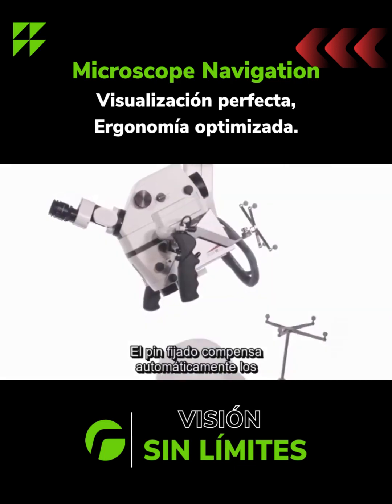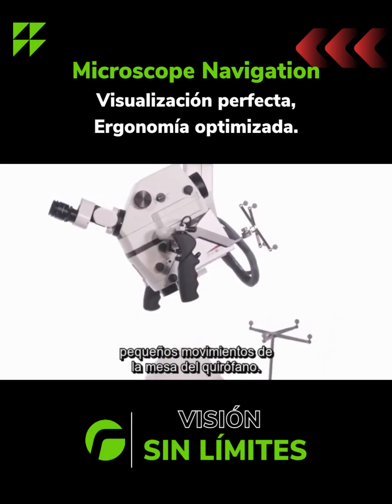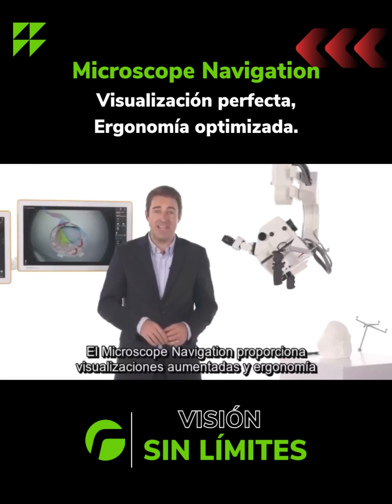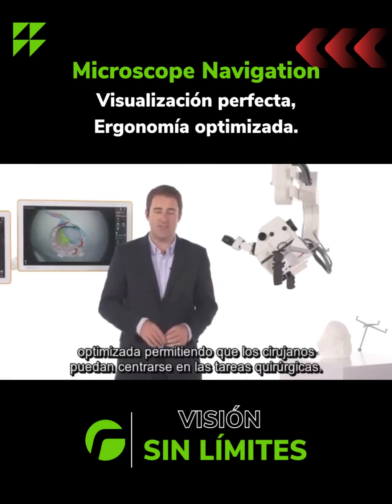Stay on pin automatically compensates for small movements of the OR table. Microscope navigation delivers augmented visualizations and improved ergonomics, allowing surgeons to stay focused on the surgical task.